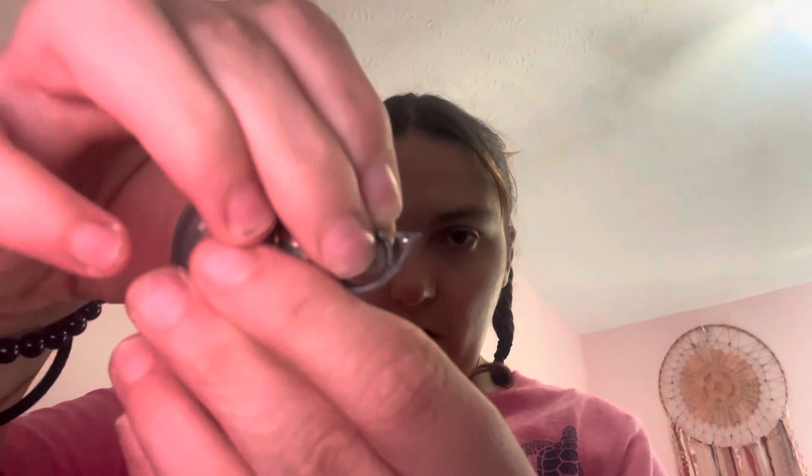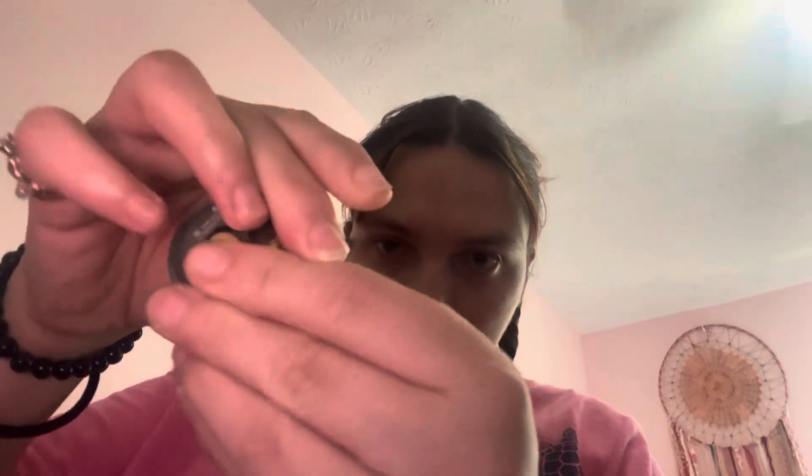So I'm gonna go like this and then fit it right through that hole — there we go, just like that — and then boom, there we go, it's on.